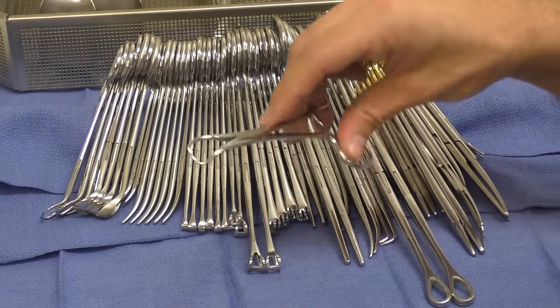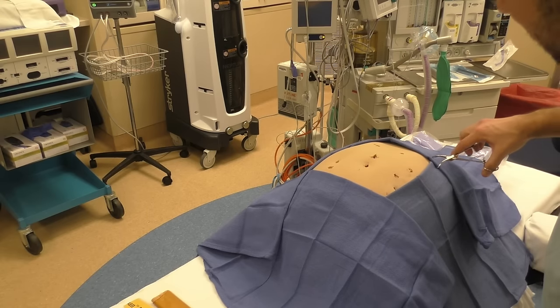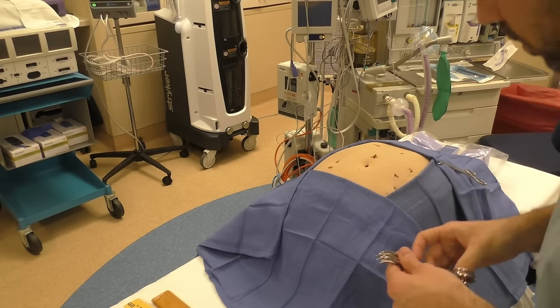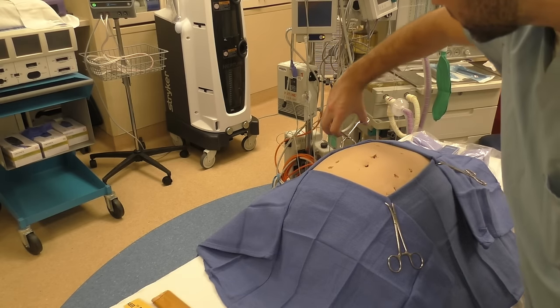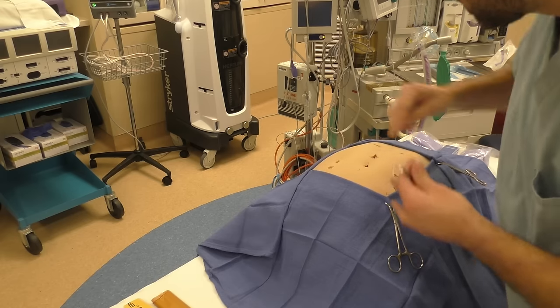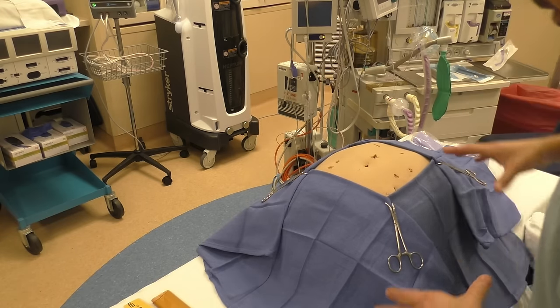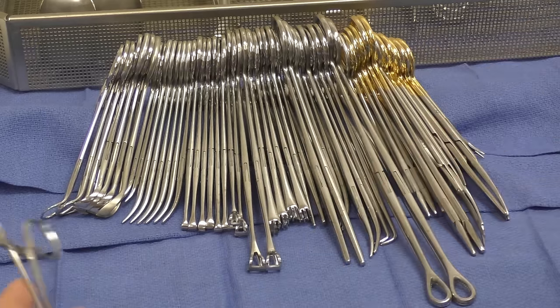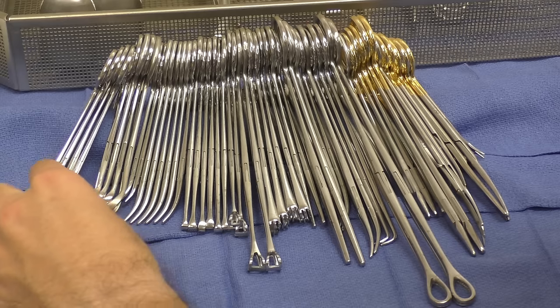Other times you may see surgeons do a four-towel square around the incision site. A lot of the time they'll like to use this Backhaus towel clip and clip the corners of the towels together so the towels don't move around while they're working on the field. Other times you may see them use a disposable stapler for that, or just nothing at all.